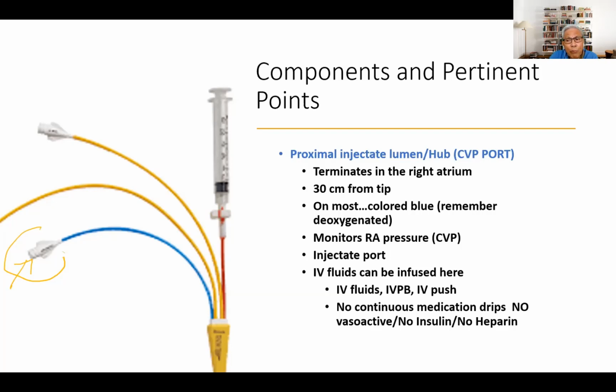In this particular port, when they do cardiac output measurements, 10 ml of fluid is usually given into this port. And of course, if you give it and there are vasoactive medications in that line, then you're going to be pushing a bolus of this medication to the patient.